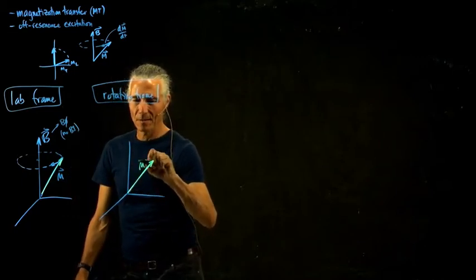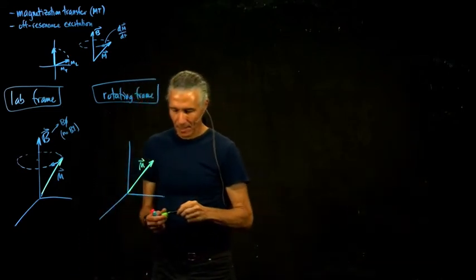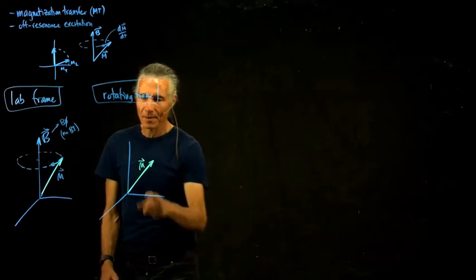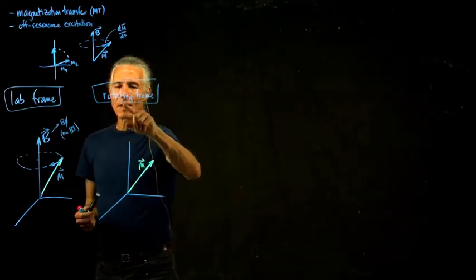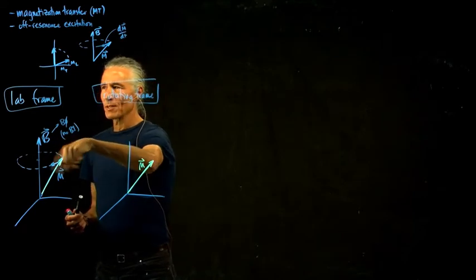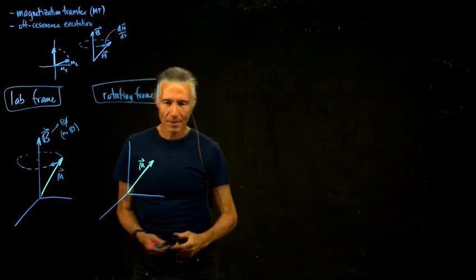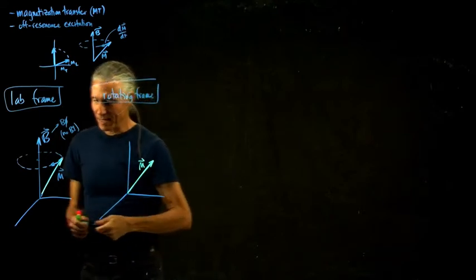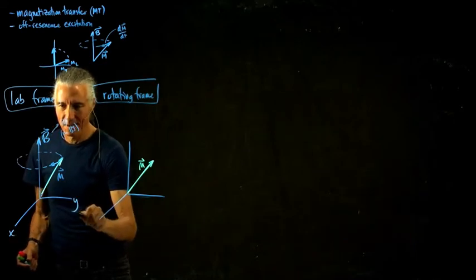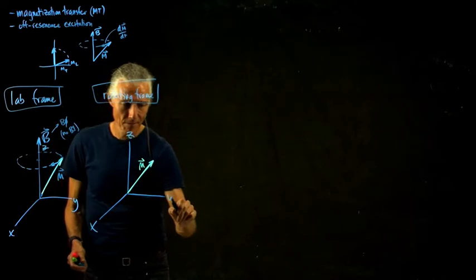So this is the magnetization vector now. It just stops if our rotating frame hits the actual precession frequency of this particular proton exactly. So now we're just completely stopped. X, Y, Z.